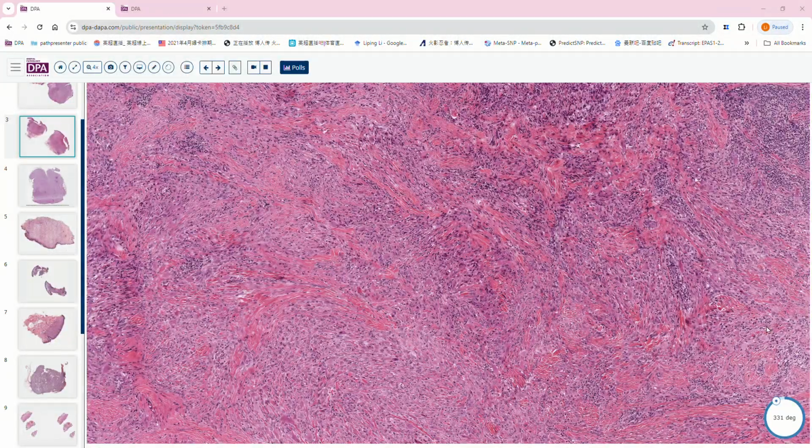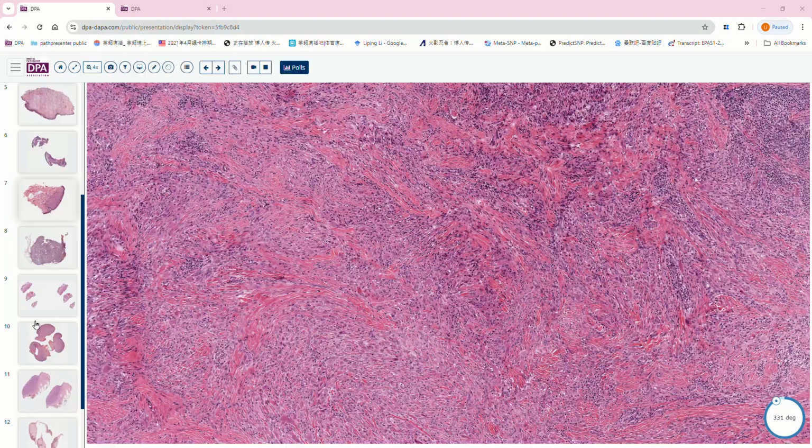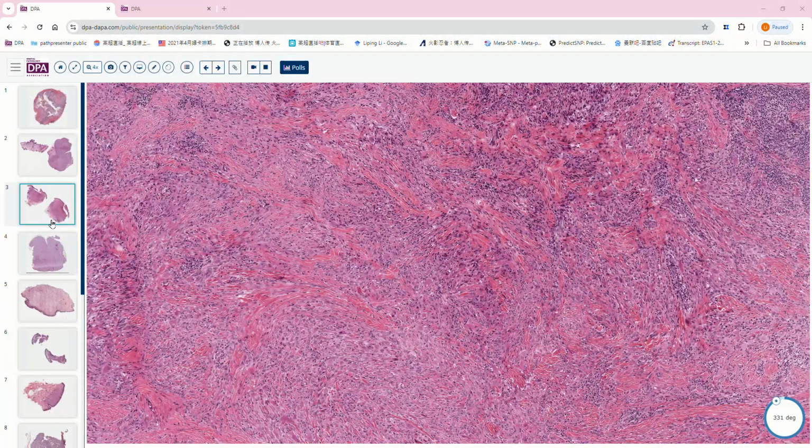Okay, let's continue. Anyone who wants to volunteer? Any other cases? Sure. Yes, we have done the first one.